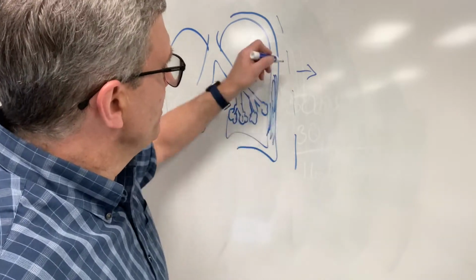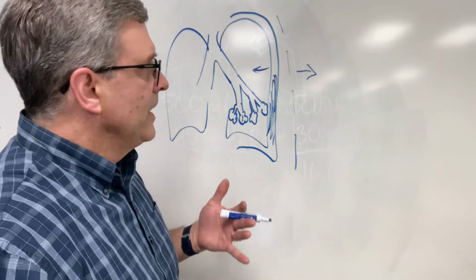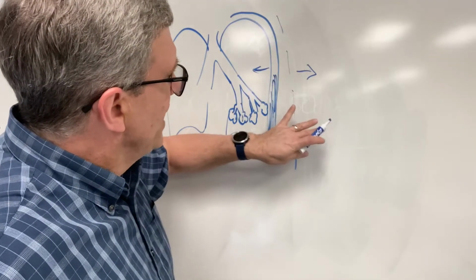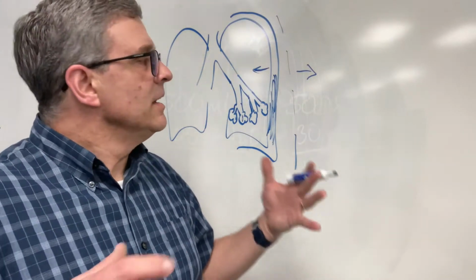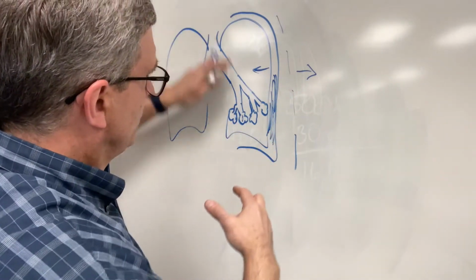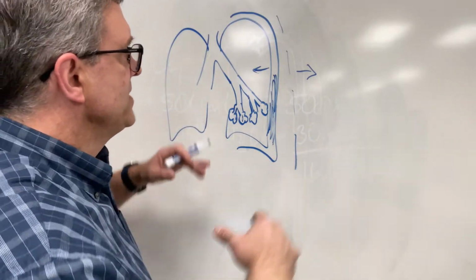And then we have chest wall things. There's chest wall deformities, you know, kyphosis and scoliosis, and we have things on the outside, like if somebody is very overweight, we have, you know, all that body fat pushing down. The lung has to push open. You know, the ventilator's got to use pressure to push that open to raise all that.